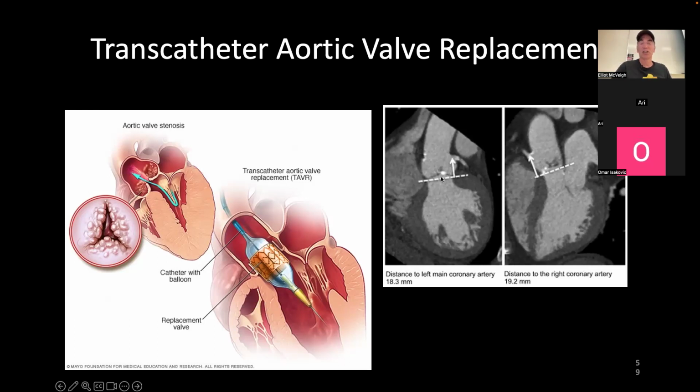It's really cool. So the other thing CT is used clinically for a lot is planning interventions where you need to know the structural shape of the heart. And one of those things is TAVR, or it's sometimes called TAVI. It's the transcatheter aortic valve replacement. And the cool thing about this is you have a catheter that goes in the patient's femoral artery, down in their groin. And on that catheter, you've crushed down a valve, an aortic valve, right?